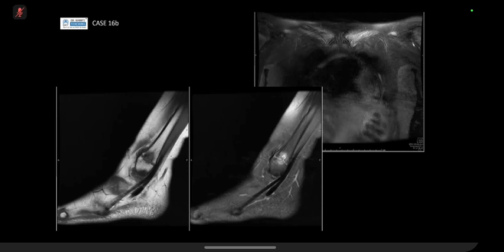And at the right ankle, there is also a bone marrow edema at the physis with a lucent, lytic, hypointense lesion seen at the physis with surrounding edema. So it might be due to multifocal osteomyelitis, since the patient has multifocal sites with bone marrow edema, soft tissue edema, and involvement at the physis, which could be due to an infectious process.